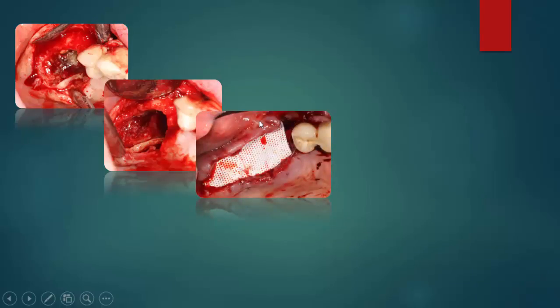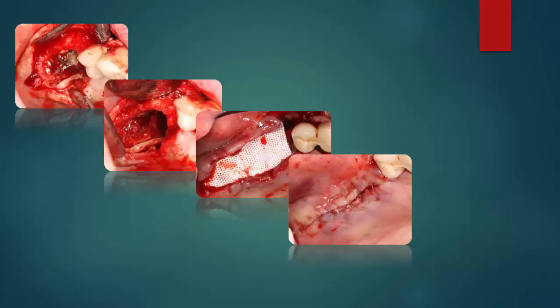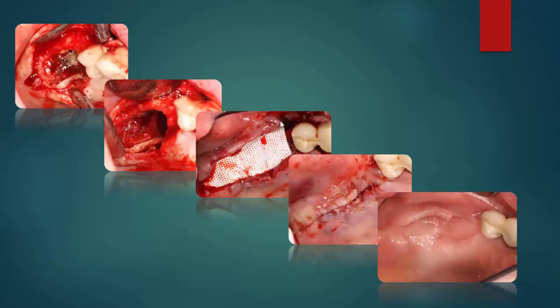We cleaned everything with saline, and then we covered the defect with a non-resorbable membrane, and then we covered the non-resorbable membrane with a collagen membrane, just to make sure that we have good soft tissue healing. And this is a primary closure again, and this is 3 months after managing this complication. So we achieved soft tissue coverage and closing of the oroantral communication.